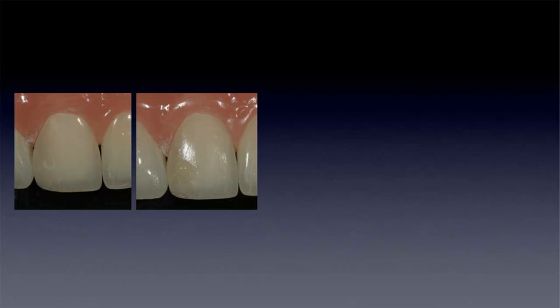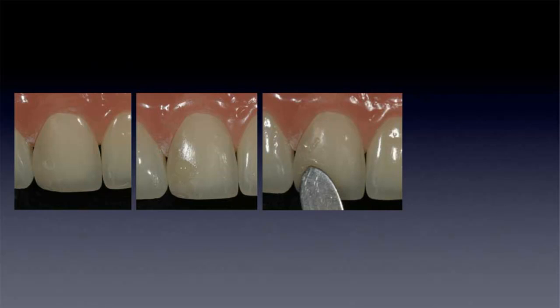And this is that product. Here's that texture. You can look at the texture that I created here. This is using a medium chamfered diamond, and then after I create the texture, I go back with my soft flex, and then I go back to my polishing.